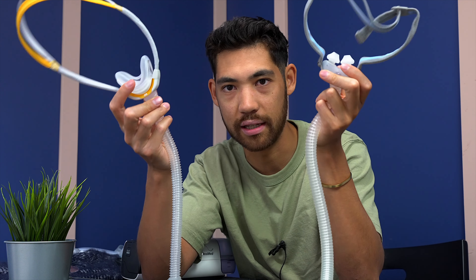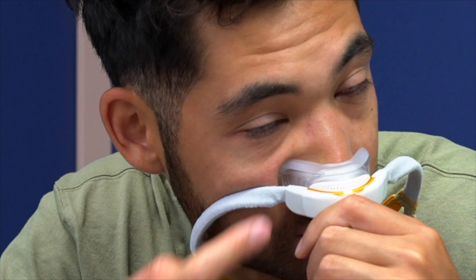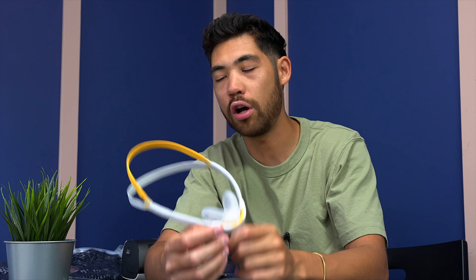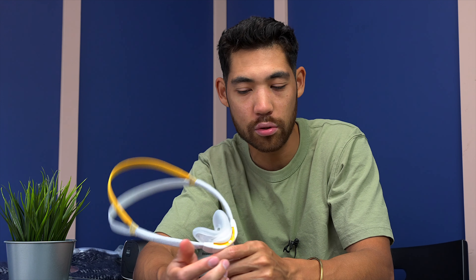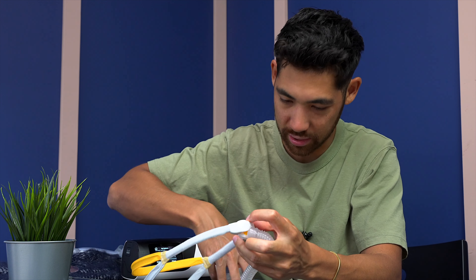Now going into the front cushion — different story, perhaps. This is the more cradle variant; the pillow version is also available. With the cradle variant of the Solo, I find the stability wings are a little bit too deep for me. I try to use the small cushion but it's too narrow and kind of squishes my nose, so I size up to the medium. I've noticed other reviewers also seem to be sizing up in this mask. When I tighten it and push my head into a pillow, once I start moving around while sleeping, there is some hard plastic digging in. If you're not pressing your head into a pillow it's not really an issue, but if you sleep on your stomach it's almost going to wake you up.